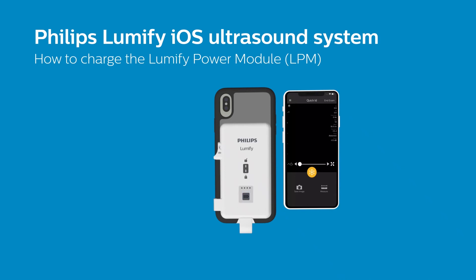If you see a single LED flash, or no flash at all, your LPM has a very low battery and needs to be charged before use.